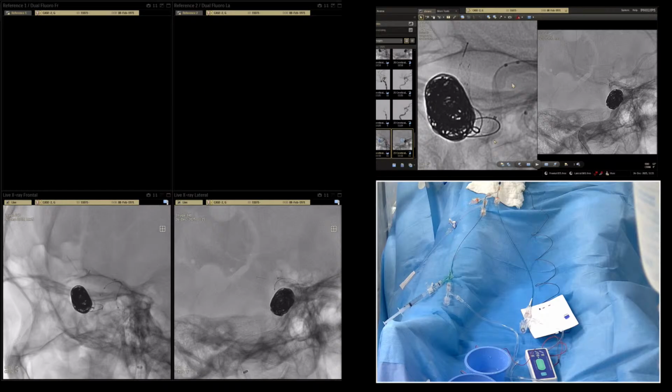Okay, let's take Optima, which is more predictable.